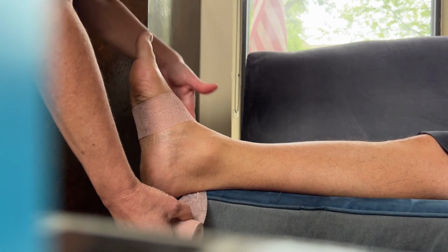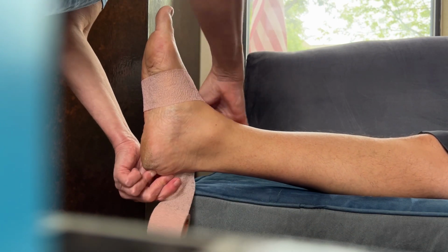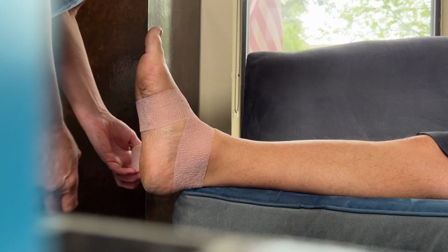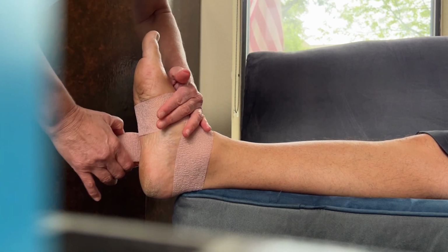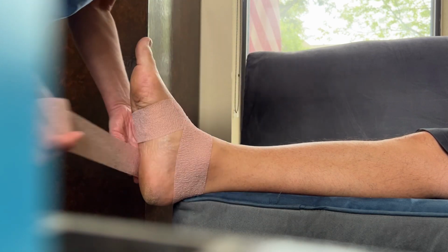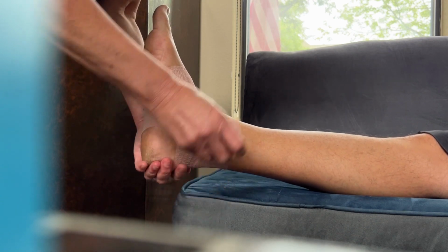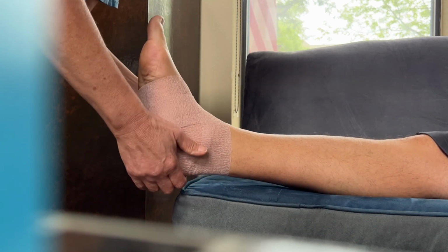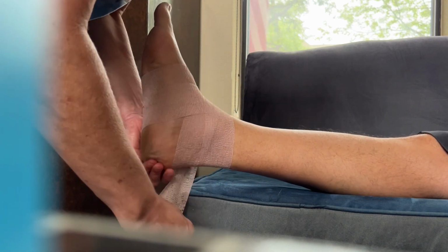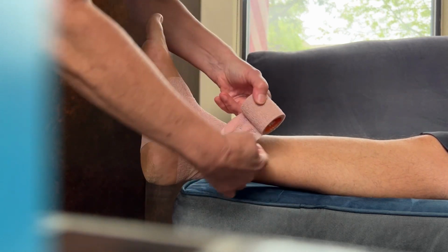So I'm starting in my figure 8 pattern. I've got him flexed to a position that doesn't hurt. I don't want him to have any pain. And so when I'm down here, I'm going a little tighter. When I go above the ankle, I'm getting a little bit looser, but still some tightness here. So I'm getting this nice little sort of figure 8 pattern, or a V, going down and up to get where I need to go, which is going to be up here. So I just continue that.